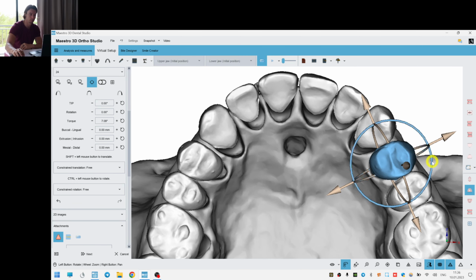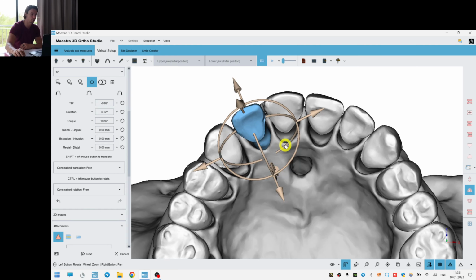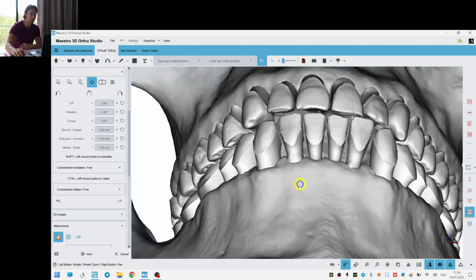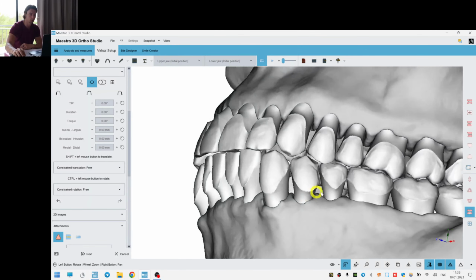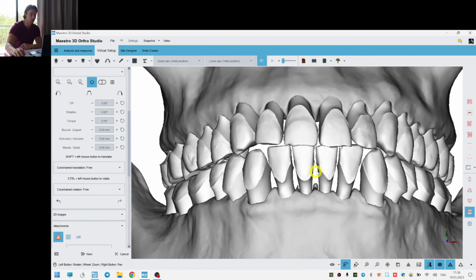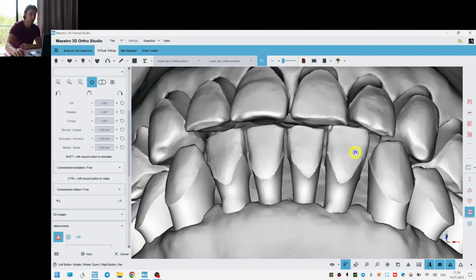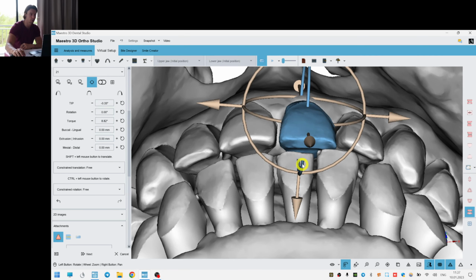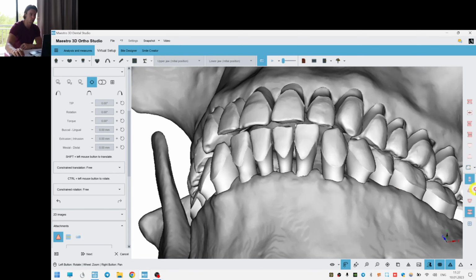We'll move second and first premolars at the same time, but we're not going to move the canines at this stage. Let's check how it looks now. Yeah, I think the occlusal contacts are fine. Get some sagittal gap, which is okay for this stage. I would even increase it a bit.